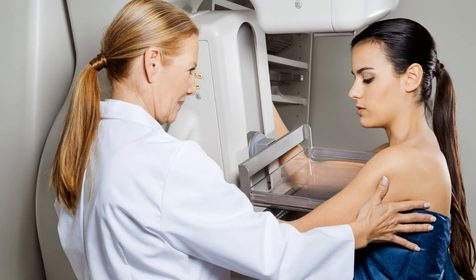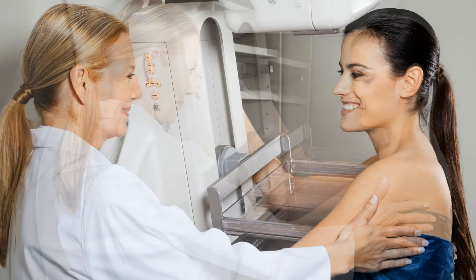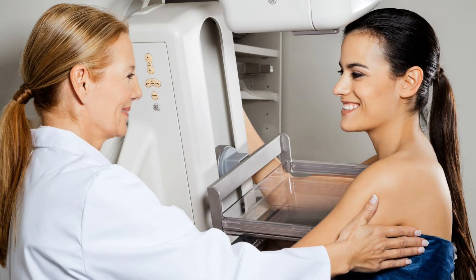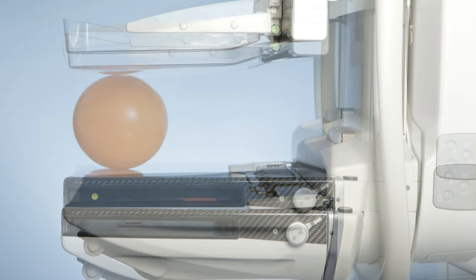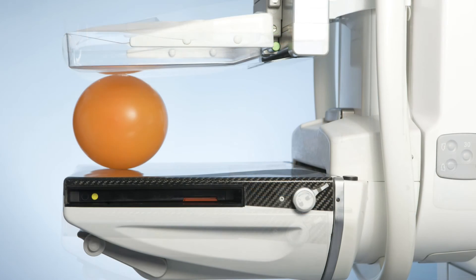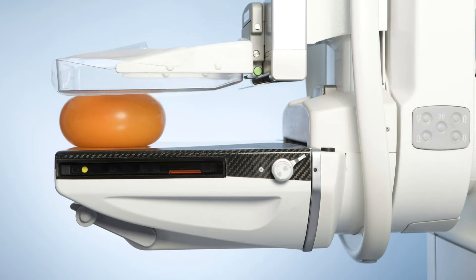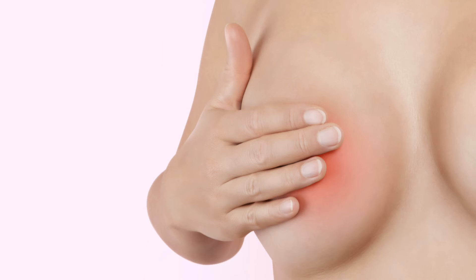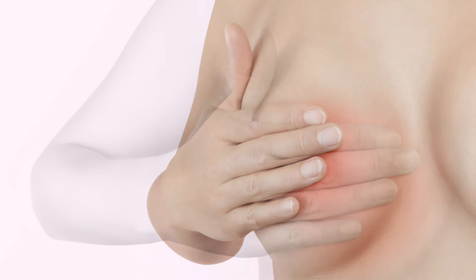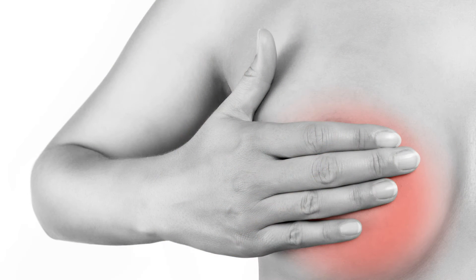Mammography is nowadays the best screening method available. Micro-calcifications are an early breast cancer finding and can be used to predict malignancy in mammogram images.